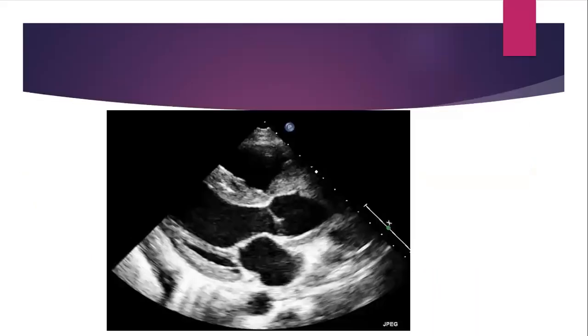This is what you see. In that one, you can see various structures. You can see the inferior vena cava and descending aorta. You can see the ascending aorta. You can see the aortic outlet. You can see the inner part of the wall, the mitral valve. There you can see the aortic outlet. You can see the left ventricle. You can see the right ventricle.